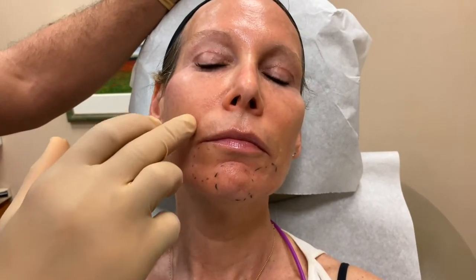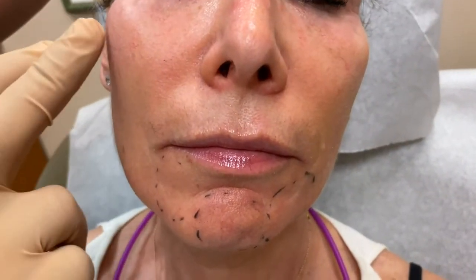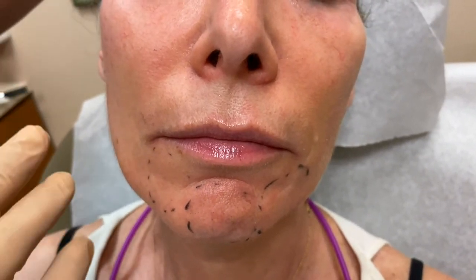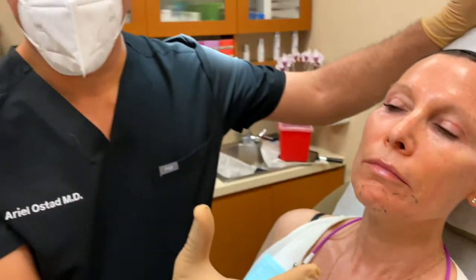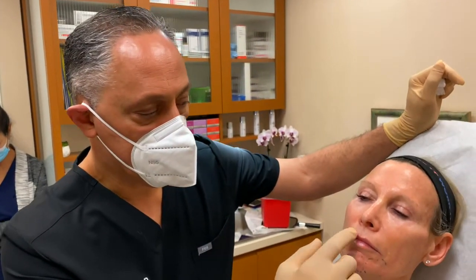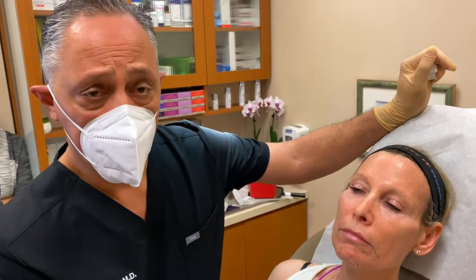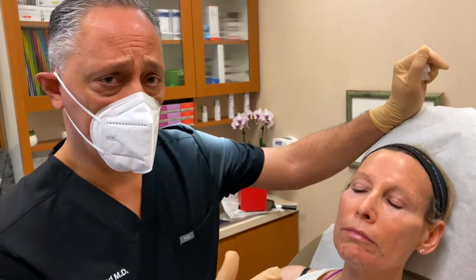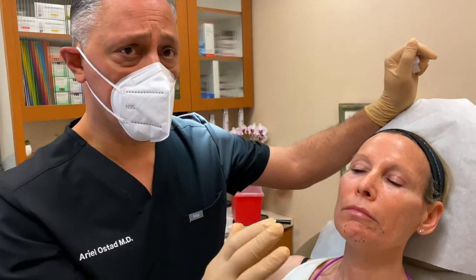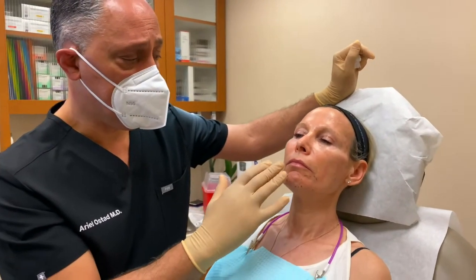Generally, patients who come in for what we call nasolabial folds or parentheses, we can inject these as well once we're done with the Voluma. For the purpose of just this session, we're really just addressing her chin, but we can also address the lip with other fillers like Volbella, which is a thinner filler, which really has longevity of about 6 months to a year, depending on how much you use your mouth. We're not going to inject her lips. We can do that in another session.